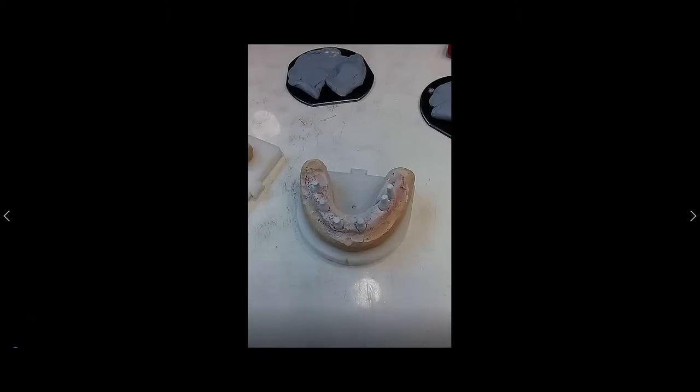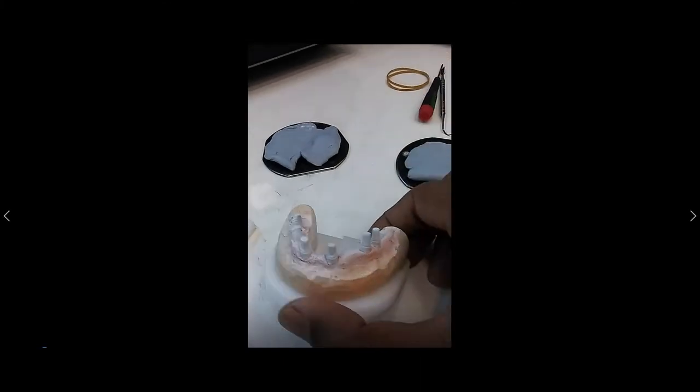Welcome to Digital Dental Technology Solution. In this video I will show you how you can scan for the hybrid bridge on the metal abutment or the prefabricated abutment. This is the case I'm going to scan today, so just have a look.